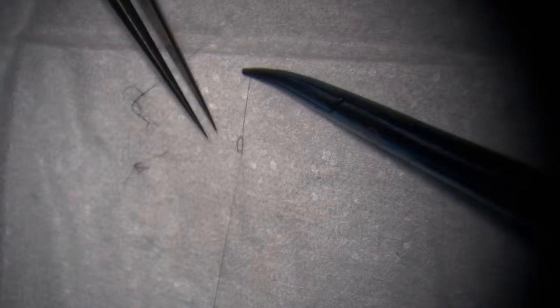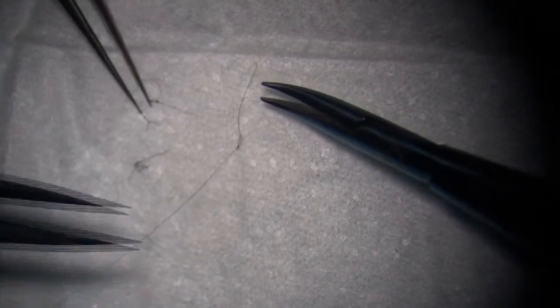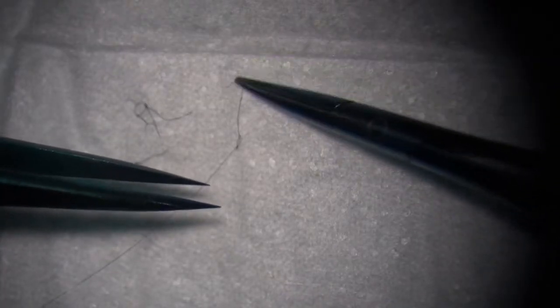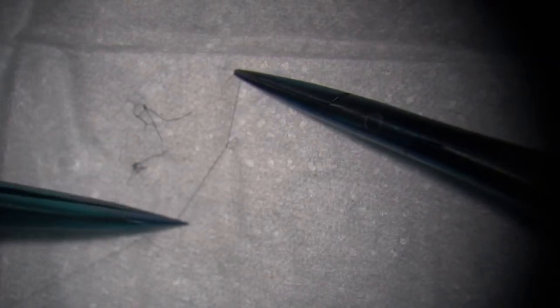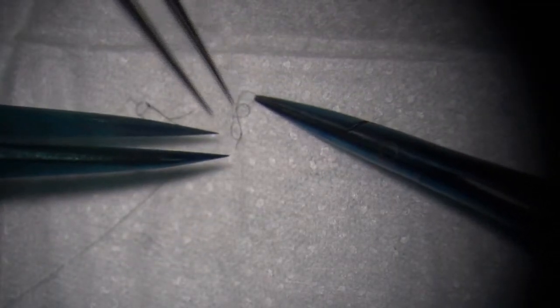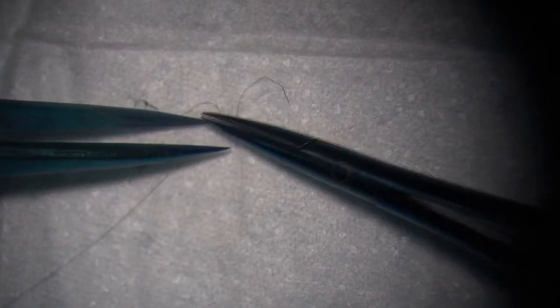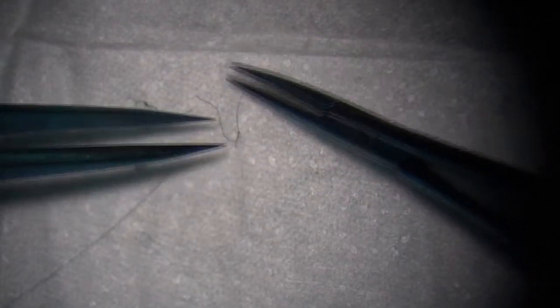Yeah, tie it down. I get it. I tie it this way to demonstrate. Oh, to visualize. So let you see the knot. Oh, I see what you mean now about tension. You only have so much before it rips. Yeah, it's fine. Now you know how much stress you will bring the suture. I learned my lesson.